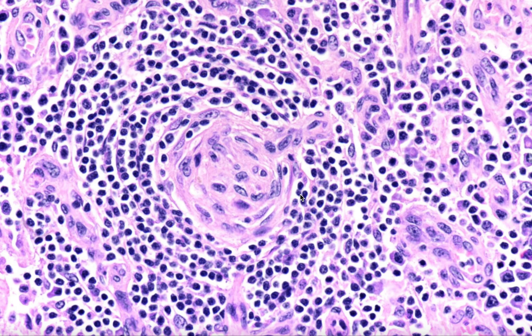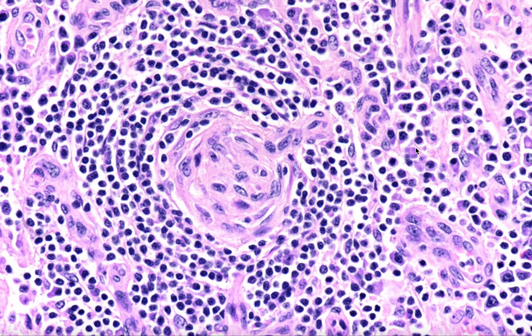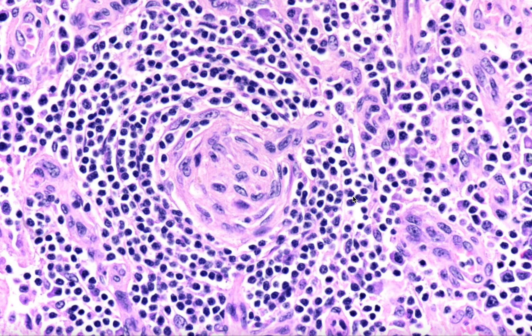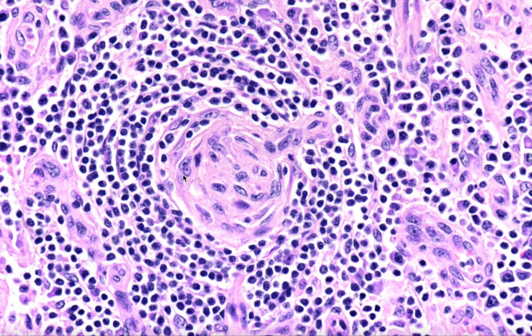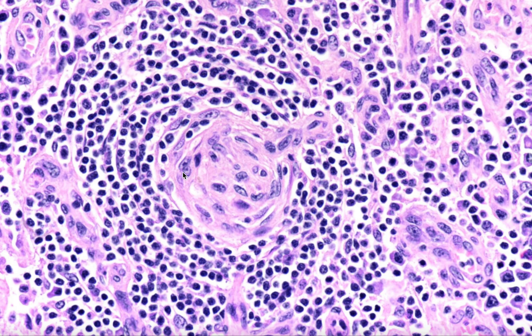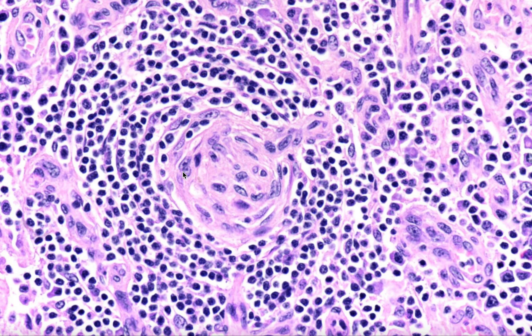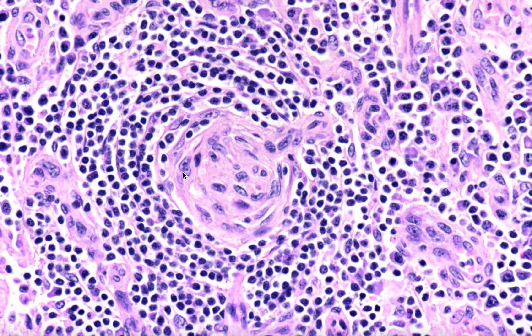Also POEMS syndrome in the setting of neoplastic plasma cells or myeloma. Sometimes these follicular dendritic cells, formed by budding or kissing nuclei, can become quite dysplastic, forming even frank dendritic cell sarcoma.